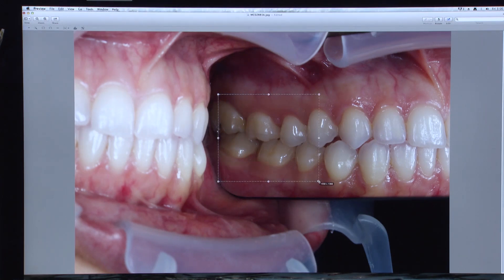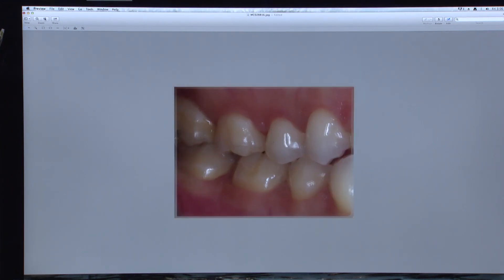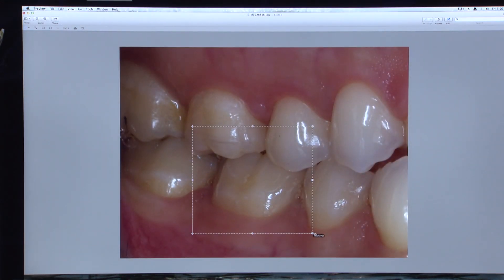My next step is to remove any evidence of the edge of the mirror, the lip and cheek retractor, and any distracting anatomical features that are present. Always take into consideration the edge of the cropped area and try to crop at a contact point or even just mesial or distal to an adjacent tooth so that the cropped area flows the eyes back towards the subject of the photo instead of away from the center.